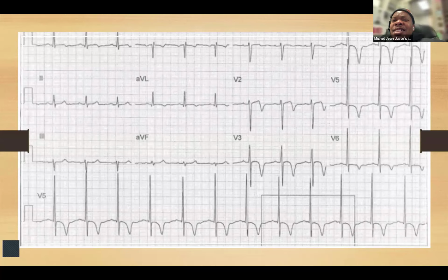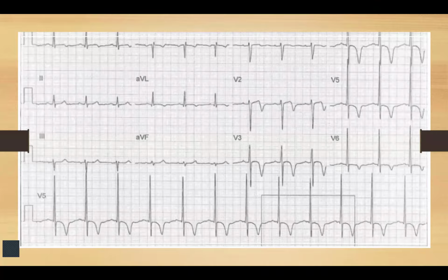I'll take a shot at it. Sure. Because of these deeply inverted T waves, I first thought it would be Wellens. Okay. What does Wellens mean?